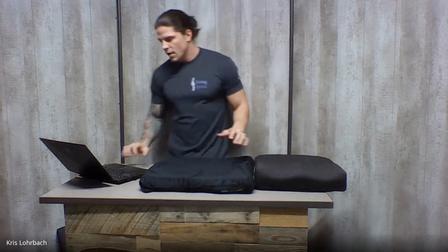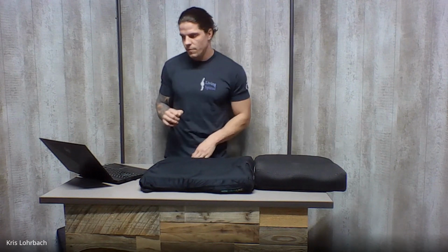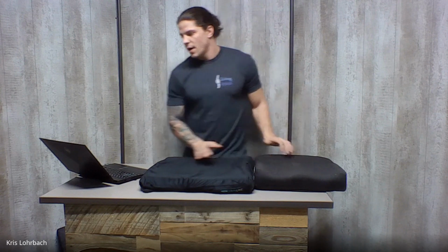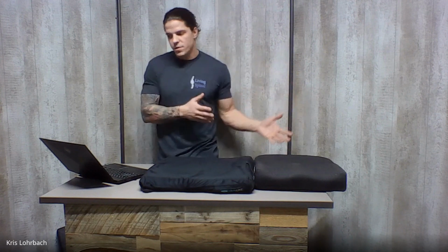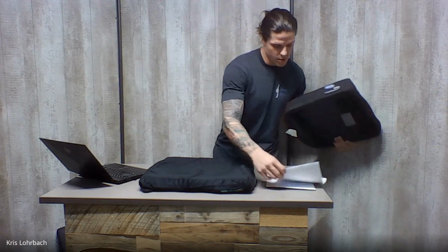The formed shape is going to assist with postural support, so how people sit upright in their chair. It's going to allow for more pressure relief, and especially in the coccyx and other areas. And it's going to fit better to the person, allowing for more pressure redistribution. And it also allows for multiple different types of materials to be used.